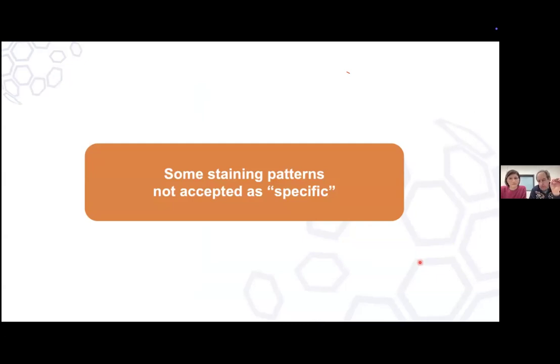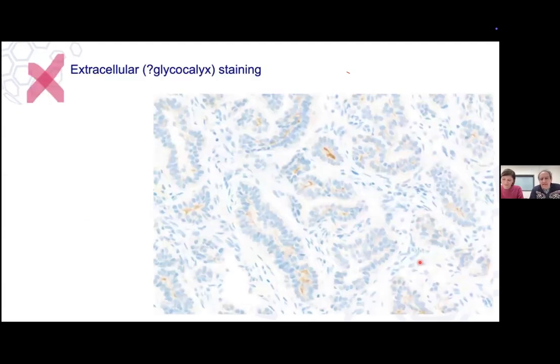Before HER2 low, because all these patterns are of low staining intensity and they are not mimicking HER2 positive things, nobody cared. I think I used to call everything positive. I mean, 1+ or whatever it is, it doesn't matter. So this one is clearly not membrane. It sits in the lumen, maybe attached to the glycocalyx. I don't know what it is.